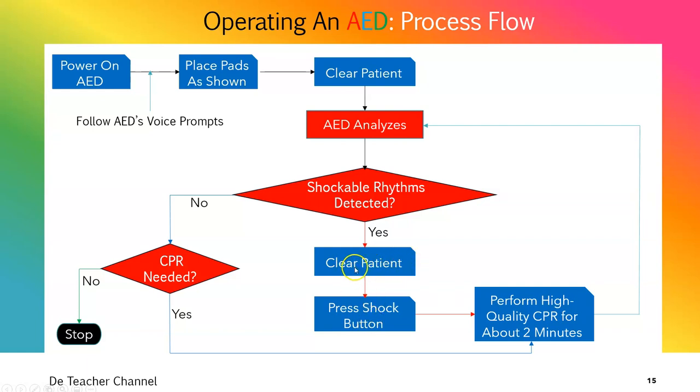This shock is capable of stopping the heart. It's capable of throwing somebody into cardiac arrest, because what the shock does is it will momentarily stop the heart and then kickstart the heart. So if somebody is touching the patient and you, by mistake or out of negligence, press the shock button, you are shocking the patient while shocking another person. That could be a very big issue here.